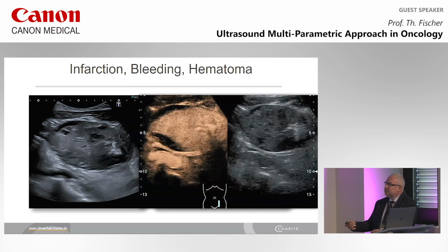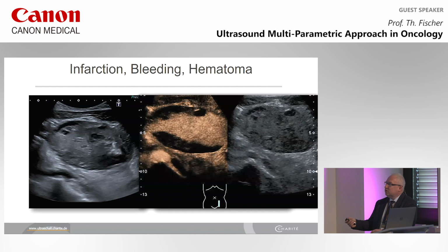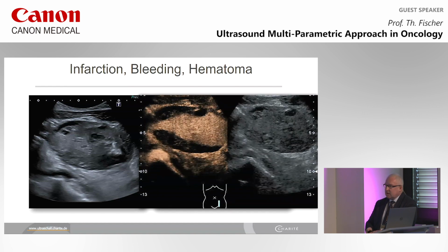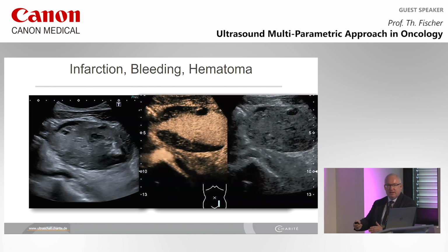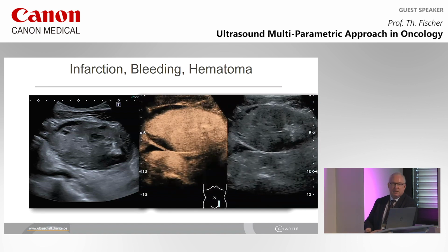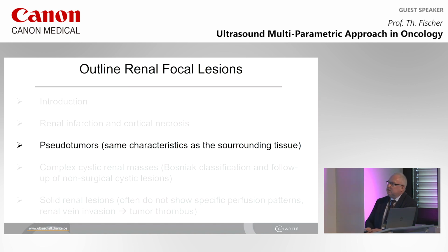exactly, free fluid here. And there was also one AV fistula visible at the beginning of this clip. So that means we are very fast to get in touch with the right diagnosis, and this patient went immediately to the operation theater. We can save the life of the kidney graft, so that's very important to know that we have this possibility available.